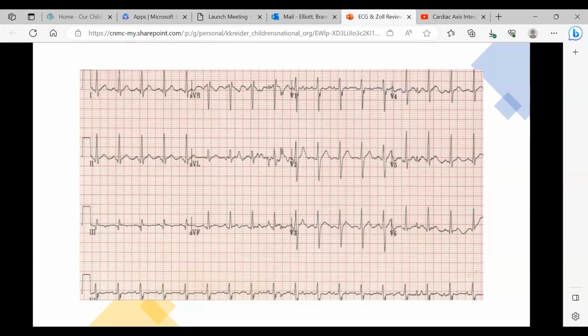All right, Lakin, chat away. Brandi, what questions do you have for Lakin? On this 12 lead that we have in front of us, is it regular or irregular? One question at a time, regular or irregular? All right, I'd like to do it all.